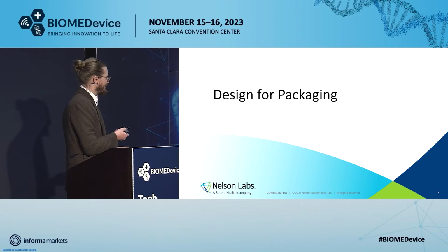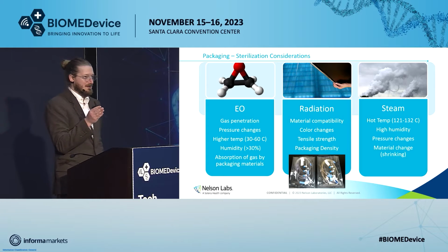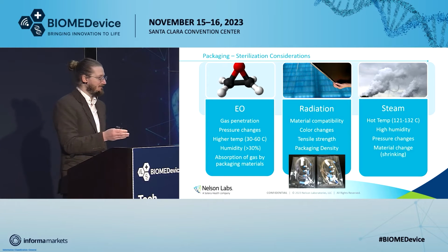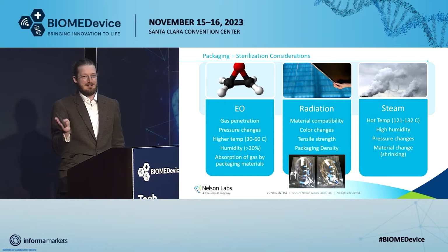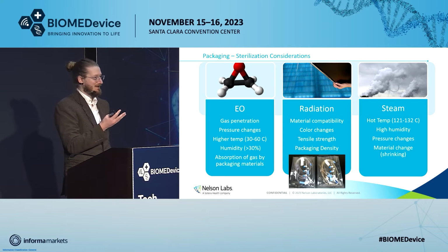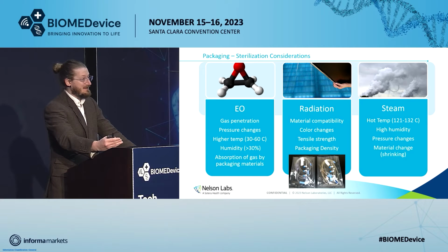So let's talk a little bit about design, shall we? Package design, even though you're thinking about functionality of your device, you're thinking about sterilization method, needs to be considered at the beginning of the process. I can't count how many, I only have 2 hands, how many fingers people have come to us to perform a package validation, and then it just turns out, you probably should have thought about this way before, because they've chosen a sterilization method that's not compatible with their packaging.